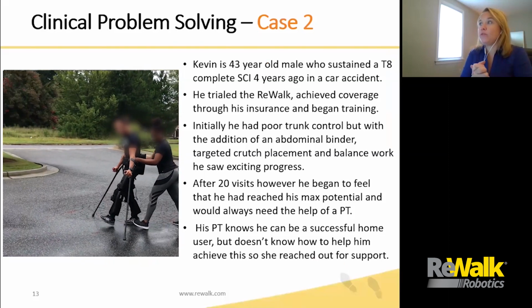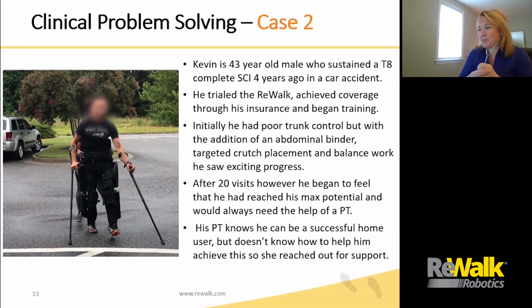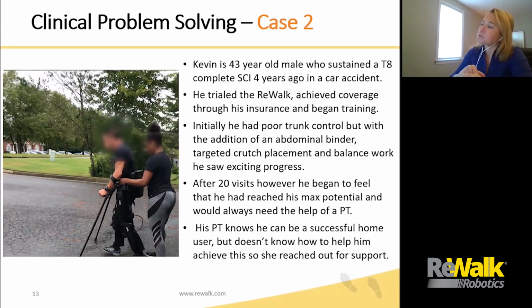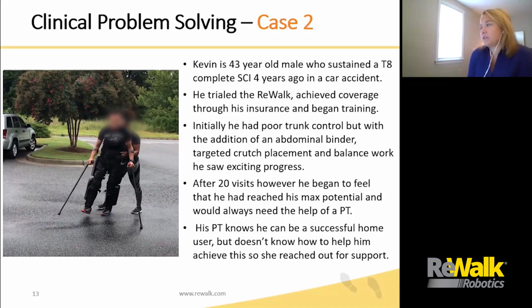Okay, so moving on to our second case. This is a user who's a little bit more advanced at this point, as you can see from this cool video of him cruising outdoors. So Kevin is a 43-year-old male who sustained a T8 level of injury, complete SCI, 4 years ago.